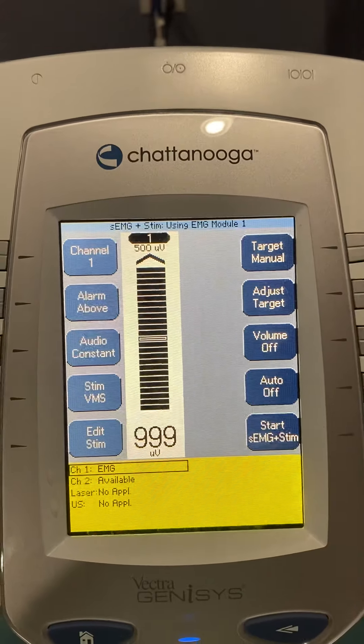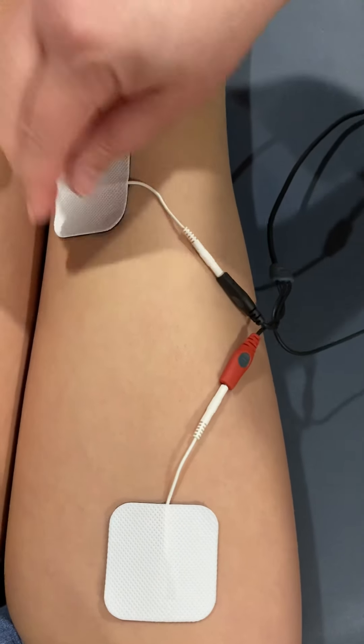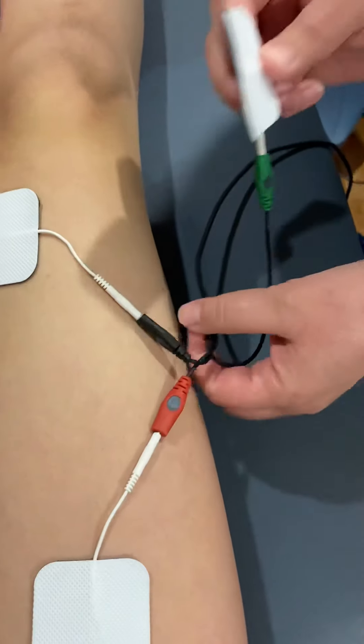Here is my patient — I'm going to clean her skin. The red and black electrodes are active. We're going to look at rectus femoris and VMO. The green is our reference, and you want the green in parallel with the first two active electrodes.